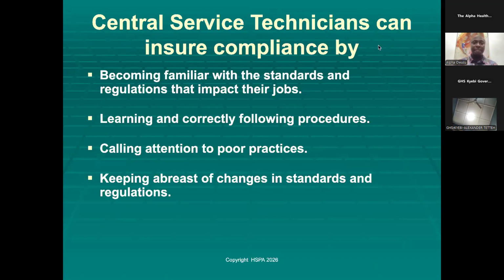Every now and then, we are having sophisticated machines, equipment, scopes, instruments, medical devices. The medical devices that were used in 2020, there have been a lot of versions. I can give you an example of the feeding pumps. Right now, we've gone to where there is a feeding pump that gets calibrated and then it's used for different patients, right? And do we have that? Sterilizers. We are having naked sterilizers in our department. Naked sterilizers, which means it's only used to sterilize single instruments that cannot be packaged.